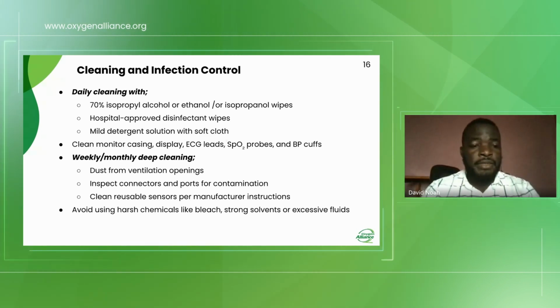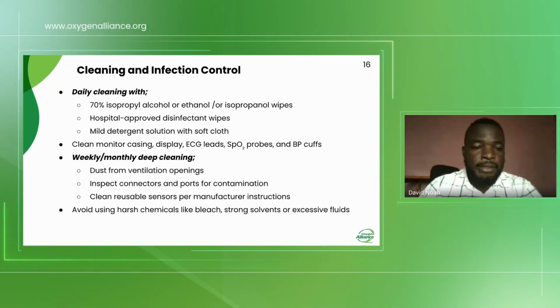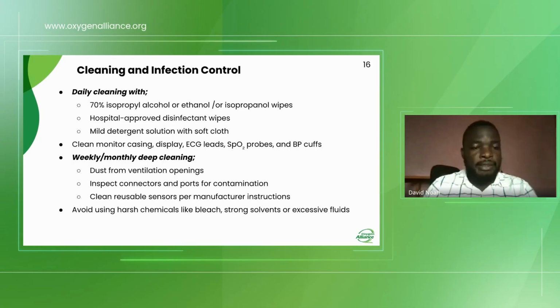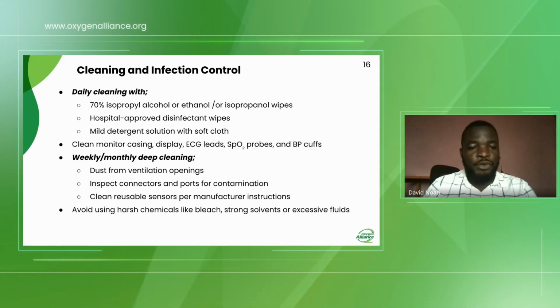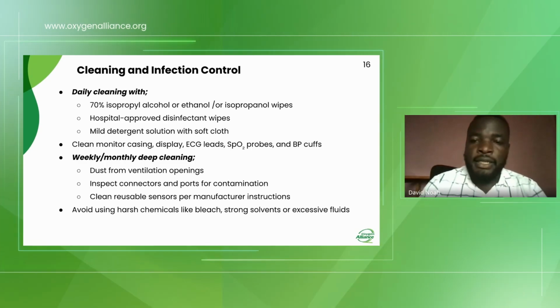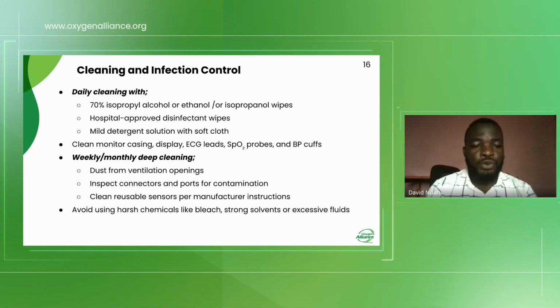Moving on, let us look at another aspect of preventive maintenance, which is cleaning and infection control. Patient monitors, as I said, are continuously used in critical care environments, and they are connected directly to patients. As such, these things need to be infection free and have to be cleaned daily, using recommended cleaning solutions.